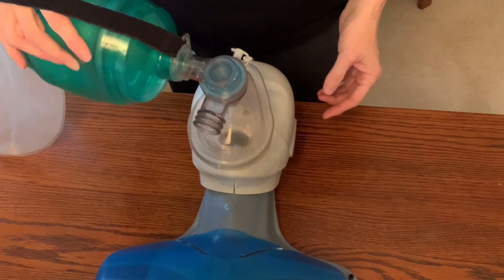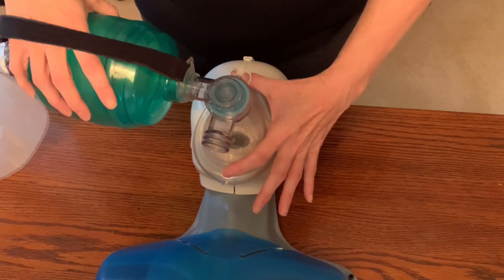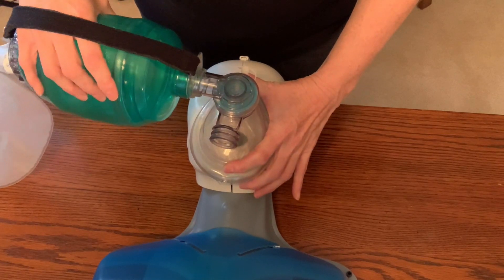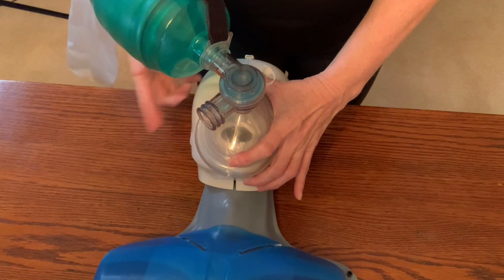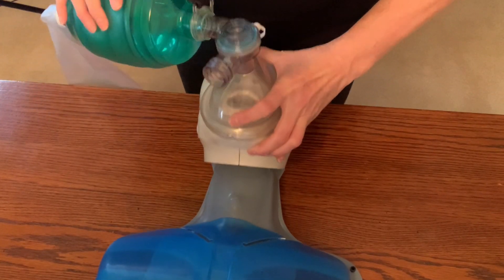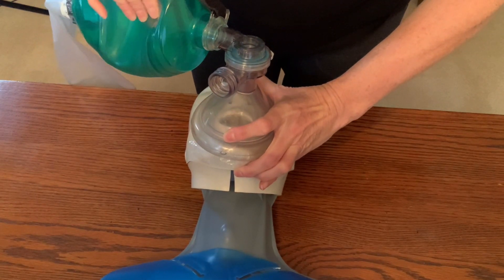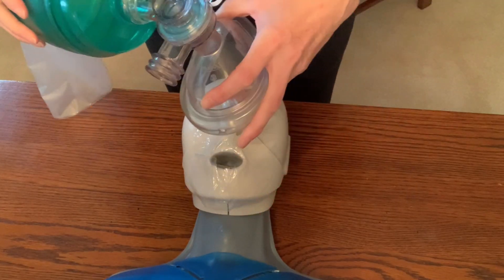A common mistake is keeping the fingers wide. As you can see, when I apply downward pressure with fingers spread, the mask tilts and air seeps out the side because it's not a tight seal — it's really awkward and you can see it's lifted right off the mannequin.